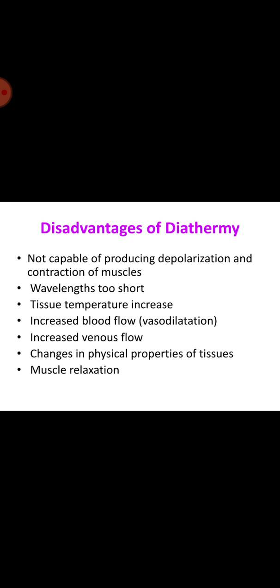Next, let us discuss the types of diathermy. There are mainly four types of diathermy available in the medical field: shortwave diathermy, ultrasonic diathermy, microwave diathermy, and surgical diathermy. Basically, a surgical diathermy machine consists of a high frequency power oscillator. The earlier types of diathermy machines consisted of spark gap oscillators, and we'll look into these types in the next model. For their action, surgical diathermy machines depend upon the heating effect of electric current.